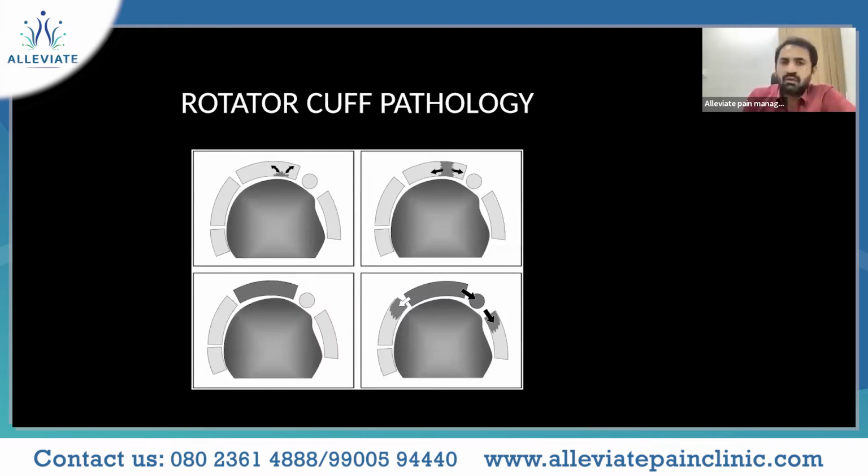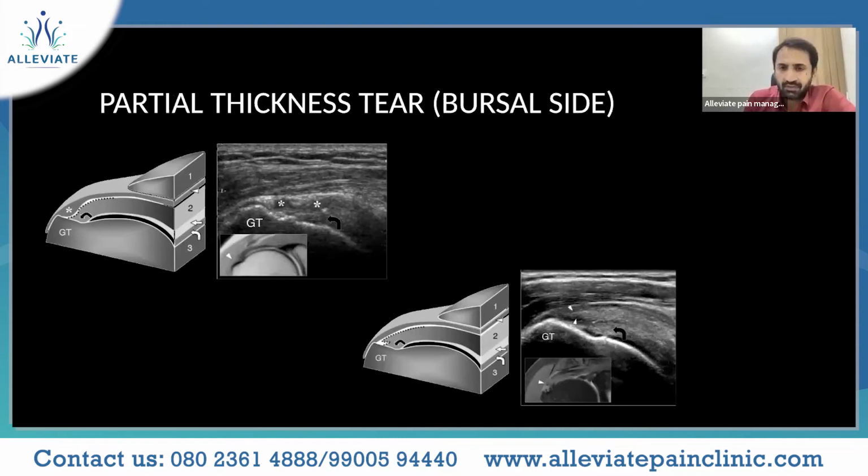Next is your rotator cuff pathology, the tears. This is a partial thickness tear which can extend, becoming a full thickness tear. Then that can extend to your anterior and posterior tendon, and there can be a rupture of that tendon. And these can further extend to your biceps and your subscapularis anteriorly and posteriorly into your infraspinatus, causing a massive tear. So here there are schematic diagrams with ultrasound images.